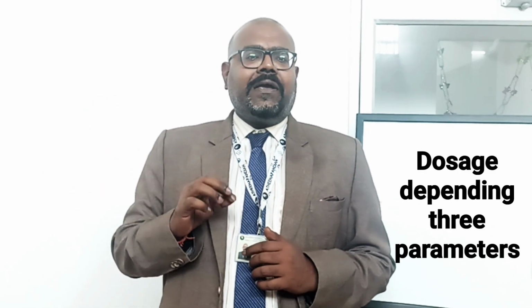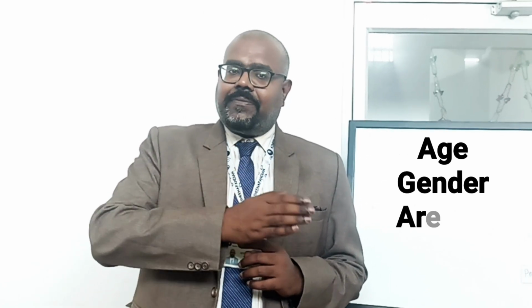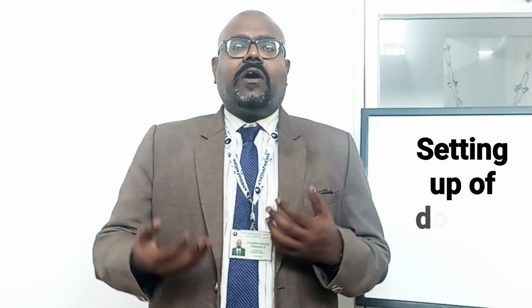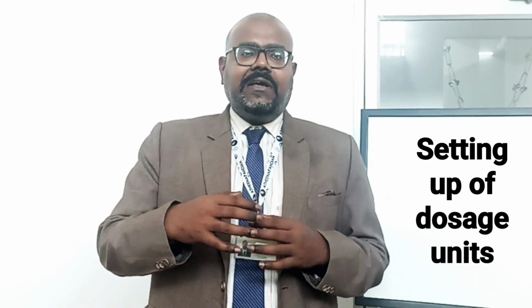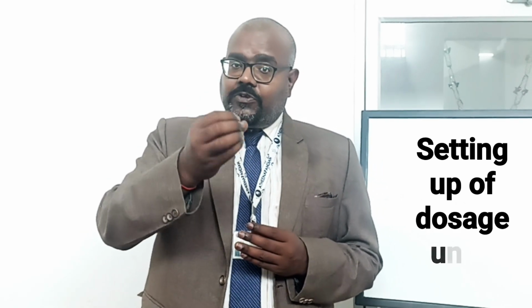These are decided by three important parameters. One is the age of the patient. The second is the gender of the patient, whether he is male or she is female. And then the area of the target, whether the doctor requires an X-ray of the wrist, the stomach or the chest, according to the penetration. These are the three important parameters. According to these parameters, the dosage limit will be chosen.